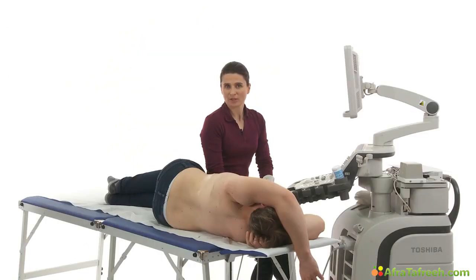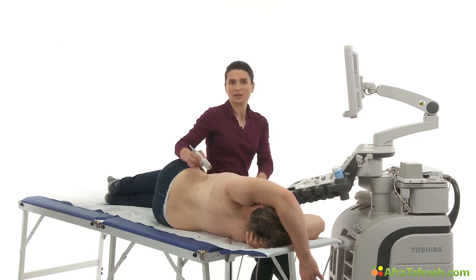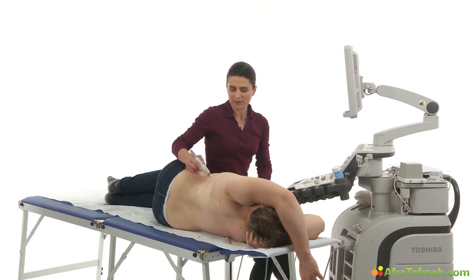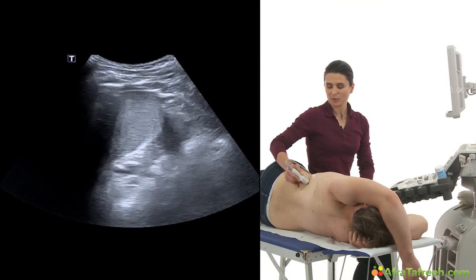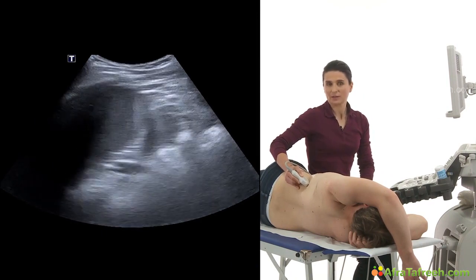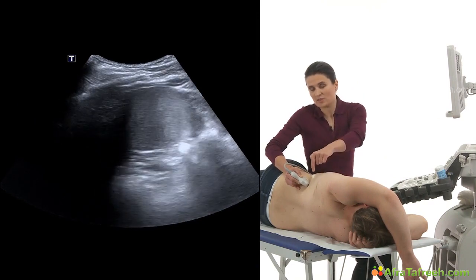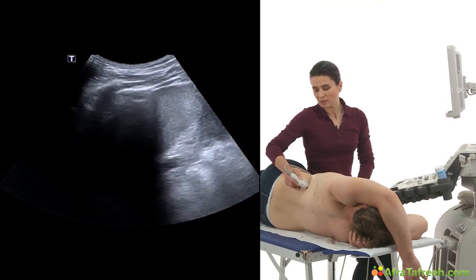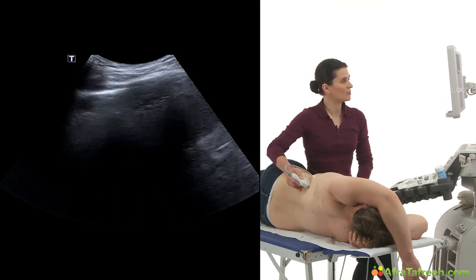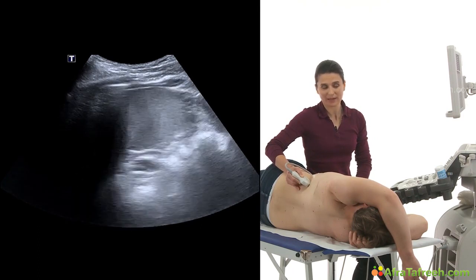Again, we ask our patient to turn on his side, this time in a right lateral position. It's easier when he has lifted his arm up like this. And we try to find the left kidney with the transducer in the left lower intercostal space. And it's about in the posterior axillary line. And as you can see, I try to get in between two ribs because I'm a little bit more cranial. I ask my patient to inhale again. Please inhale.